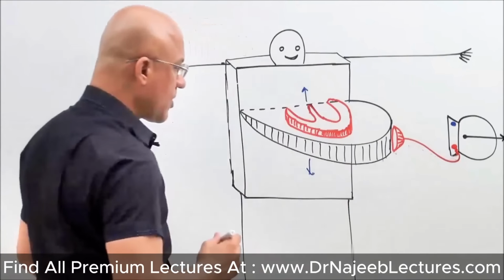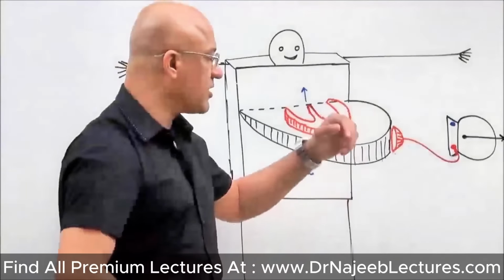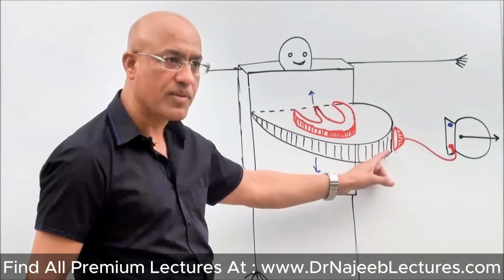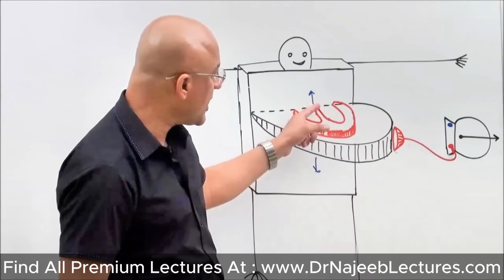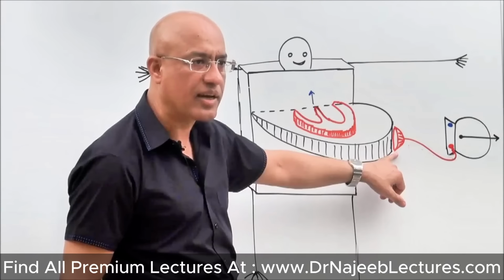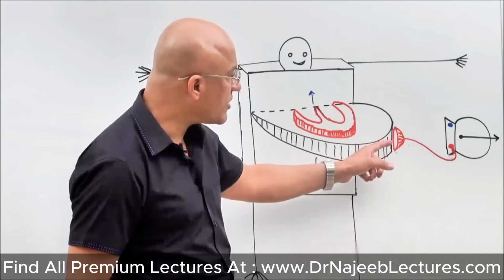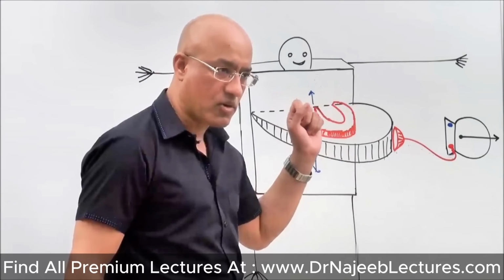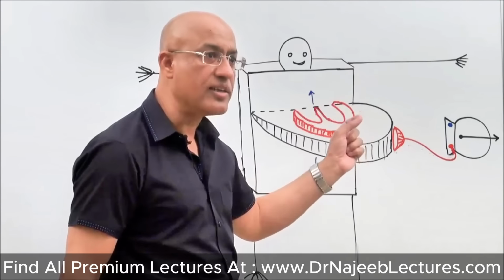We have applied the positive electrode on the surface of the chest. In this case, whatever electrical activity is transmitted along the horizontal plane, this positive electrode, or more truly speaking, the exploring electrode, will be able to detect. This exploring electrode will detect the electrical activity in relation to the indifferent electrode, the near zero electrode.